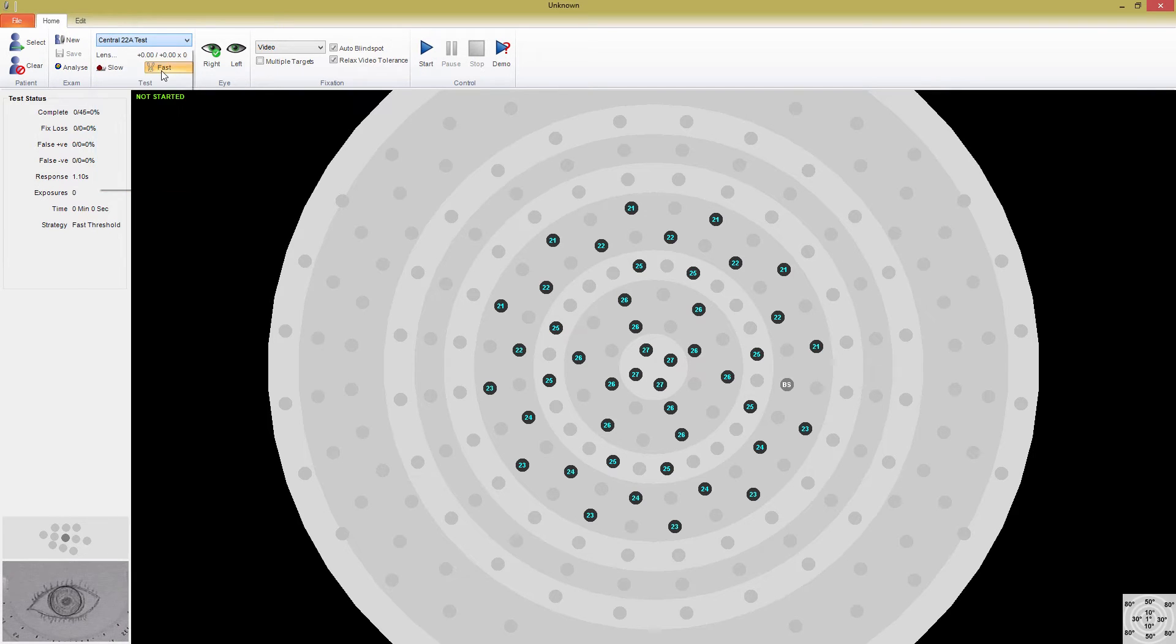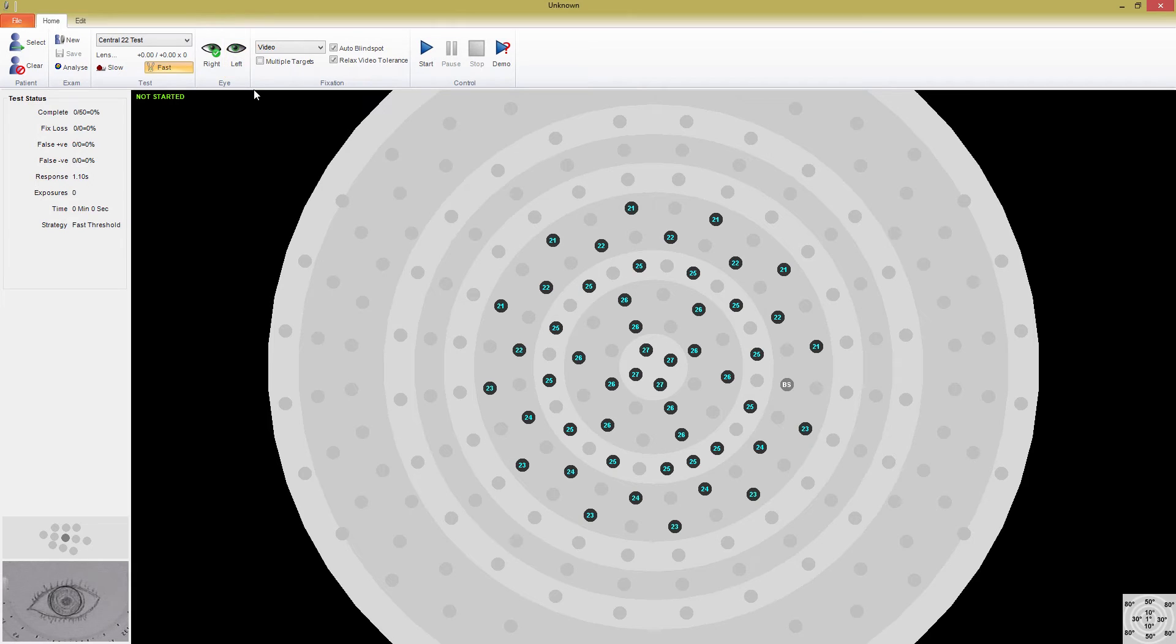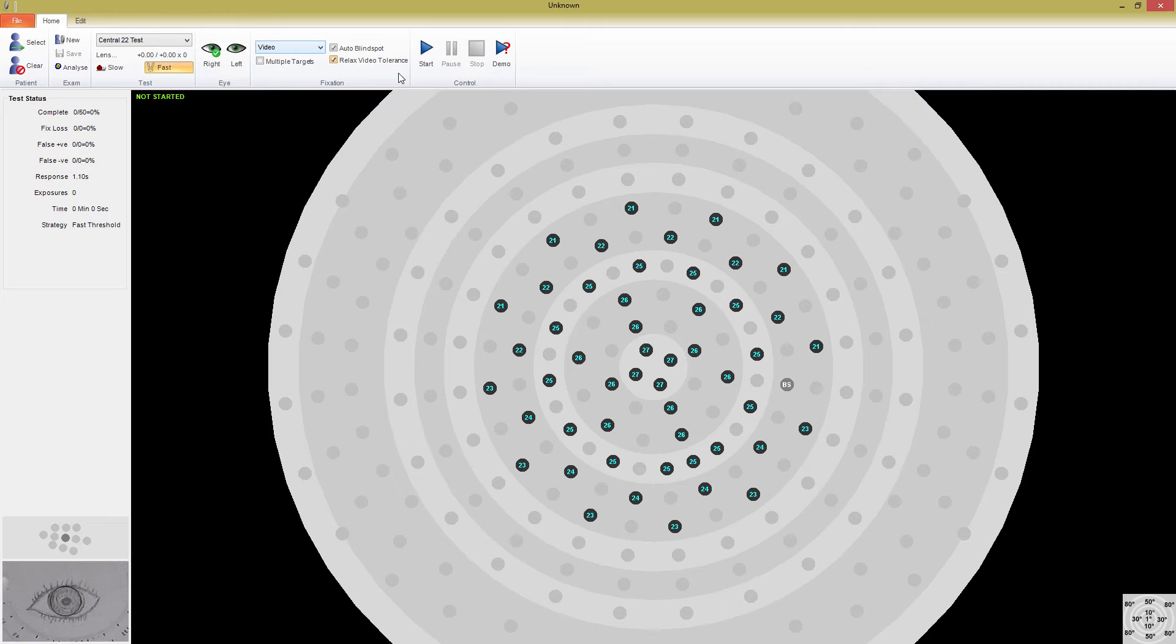For this test, I will use video fixation monitoring. When the patient is ready, all you need to do is press the Start button, and the test will begin.